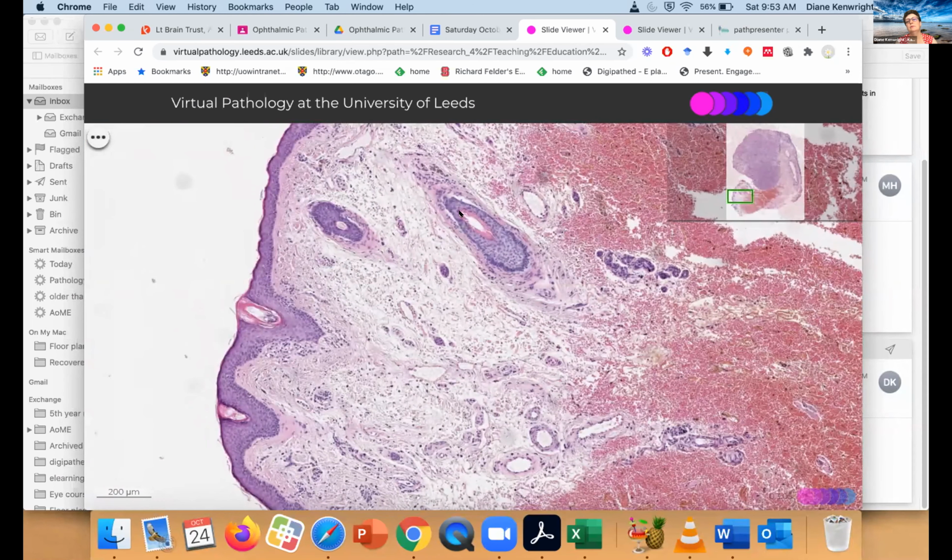Can you explain the junctional features? All right, so all nevus and melanoma related lesions arise at the junction of the epidermis and the dermis. And usually in melanomas, if we look closely, even big ones, we can see here that there is a residual junctional component. Now, because it stretched the epidermis over the top so much, really, I couldn't see good examples of pagetoid spread.